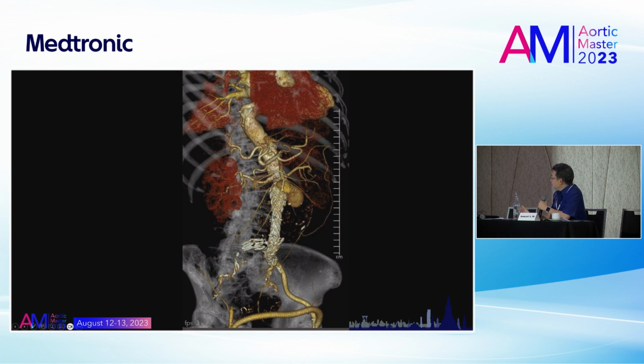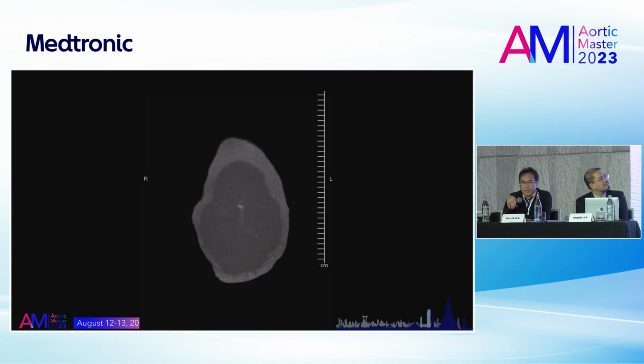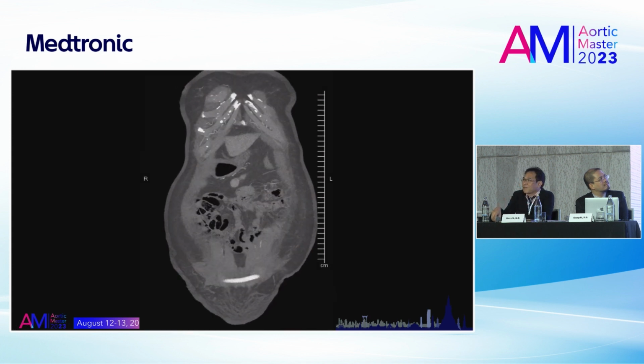Yeah. Now I would begin to try the PMEGS to both renal arteries. Oh, okay. And an aortic cuff extension would be another option. Okay. Anybody else has any opinion on what to do?